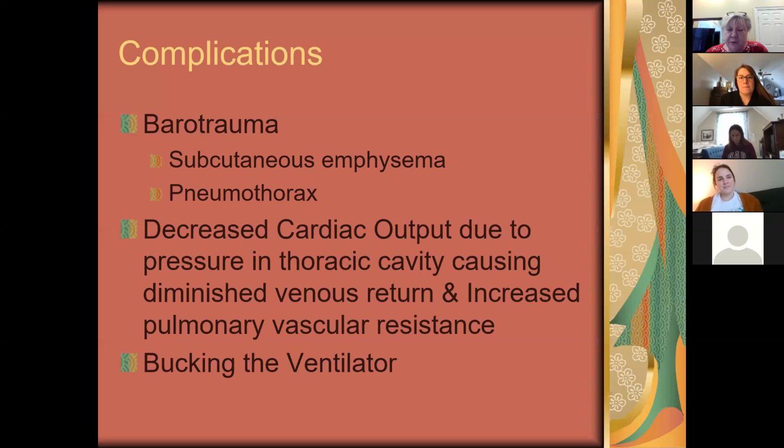It could be ICU care 3. I don't know which way's worse. And when the docs write that, then the respiratory therapist sets all the ventilator settings. They make all the orders for ventilator settings. At CMC, it's almost that way. At smaller hospitals, respiratory doesn't usually do that. The docs usually write the settings. So it all depends on the policy of your institution. But at CMC, respiratory can change the settings.